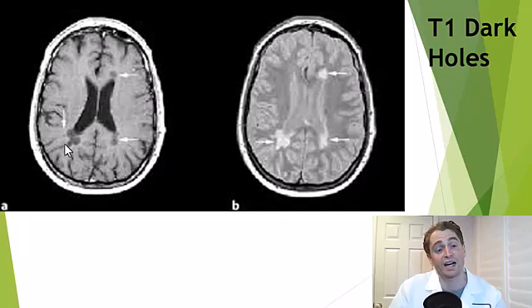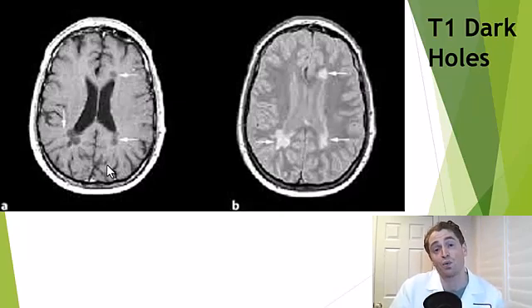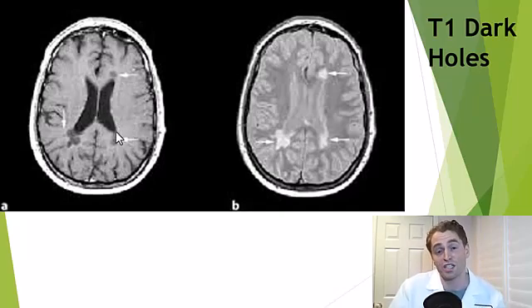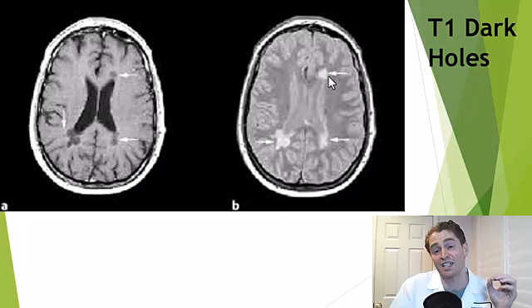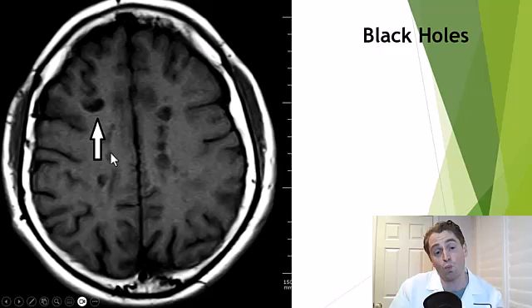Most people with MS are going to have some black holes, but when they're very extensive, especially when accompanied by atrophy, that's correlated with more disability — more so than just the T2 lesion burden. This is another example of subcortical T1 black holes.